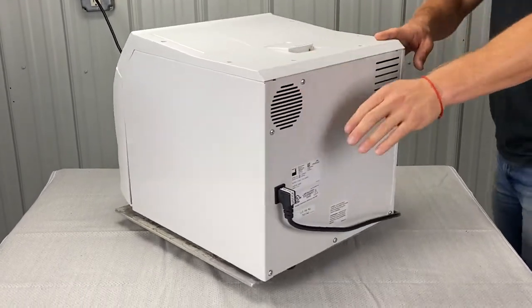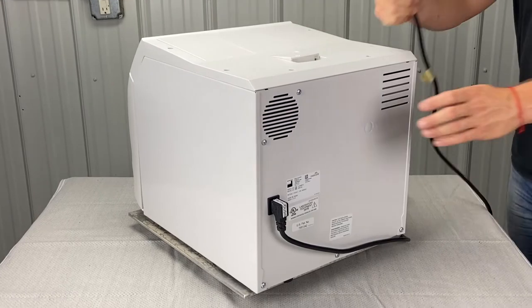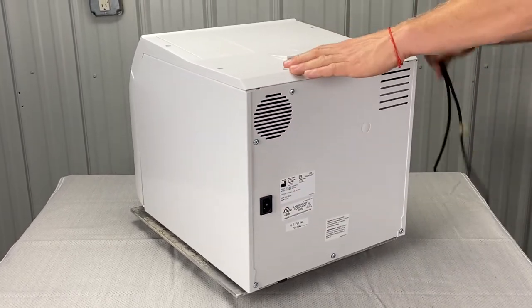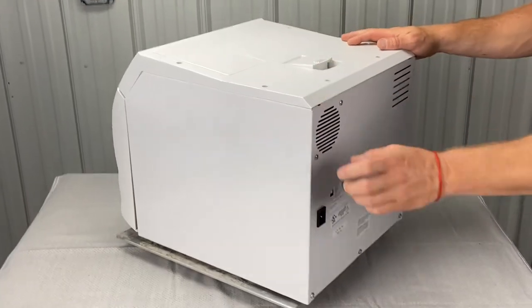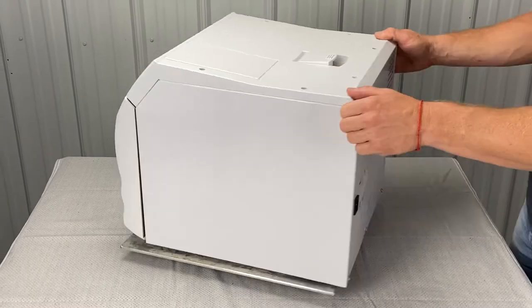First thing we'll need to do is unplug the unit — I would do it from the wall and then from the back here. So it's four pieces: a top cover, back cover, and two side covers. You'll see why we have to do all of that in a minute.